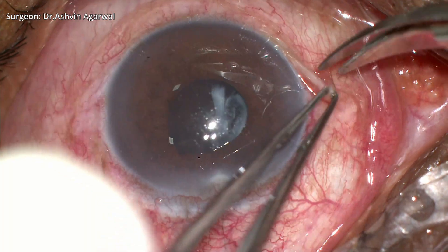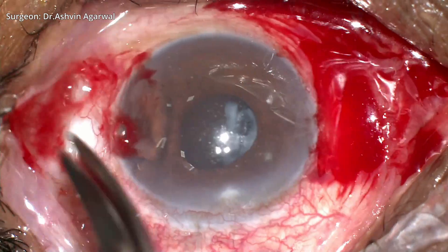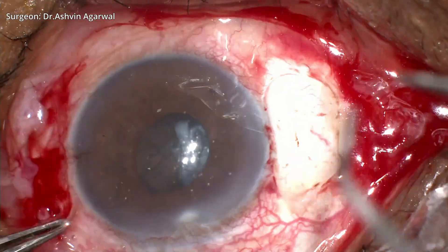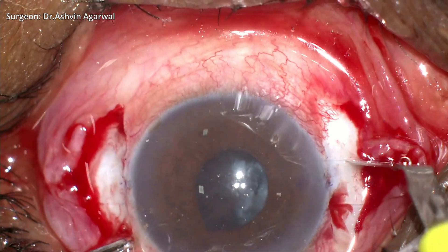We start off by measuring the white-to-white diameter of the cornea using a caliper. The flaps are usually positioned 180 degrees apart, and using the glued IOL marker we mark the site of the scleral flap.